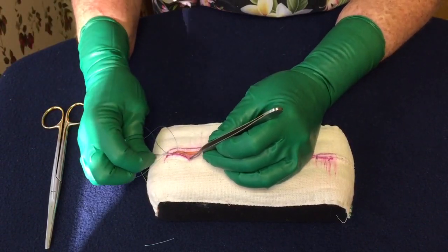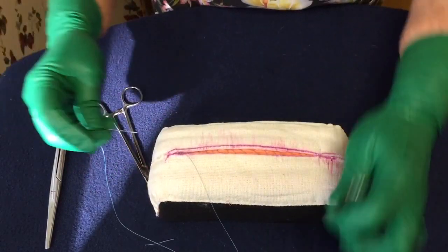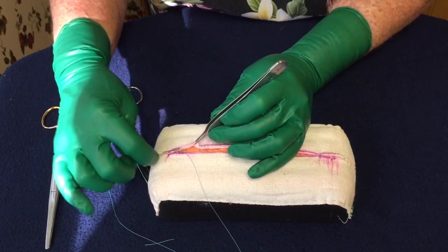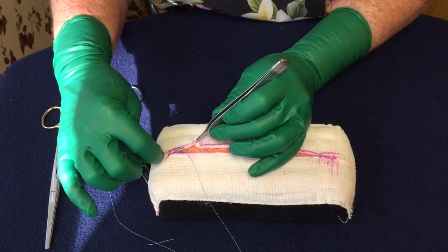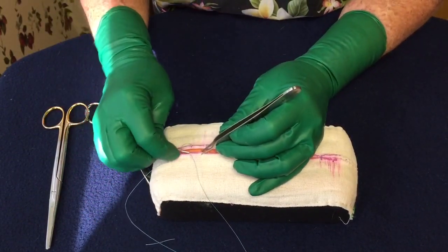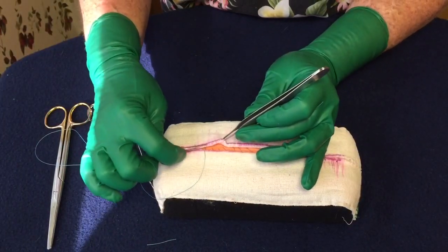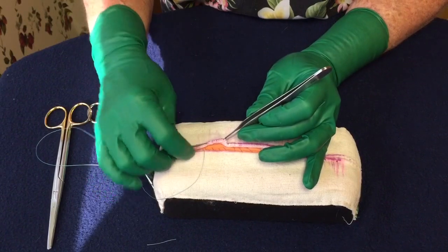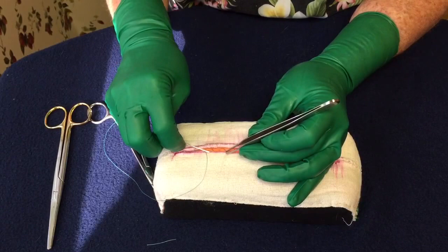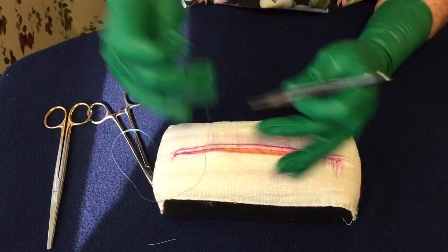Remember, you go two throws before you pull it through — that's about the right length for them. Now I'm going to start taking bigger ones so we can get to the other end; then you just do your running subcuticular. This needle is a little big for this and it's also catching on the ace, but you can go through both sides. The way I'm doing it, I'm pushing with this finger as I push it through.